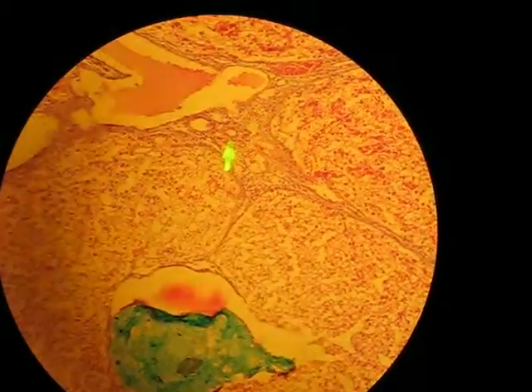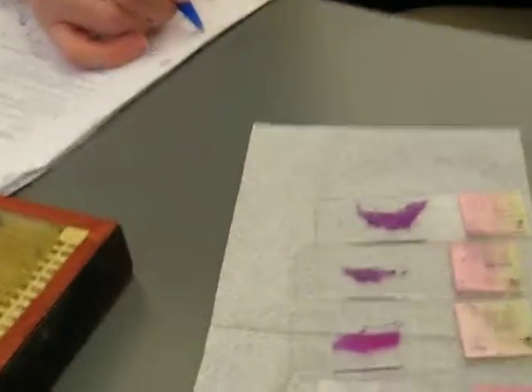Got it. The central vein also often isn't quite round because it's being fed by the sinusoids, right? So it sometimes looks funky. The central vein does. Instead of being round, because all the sinusoids are feeding into it at whatever level they're coming in, it may have a funky shape and really not be round. So that's another clue. Are the lobules like skipping up more?